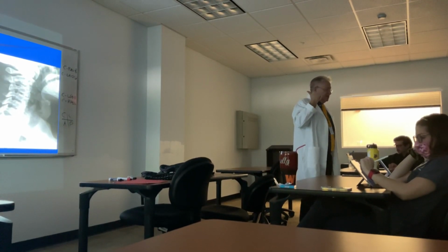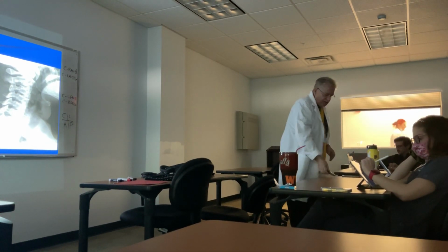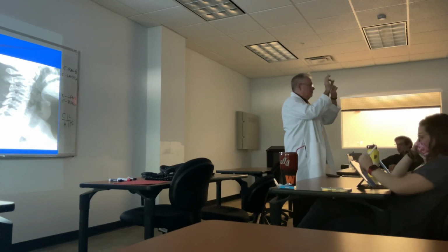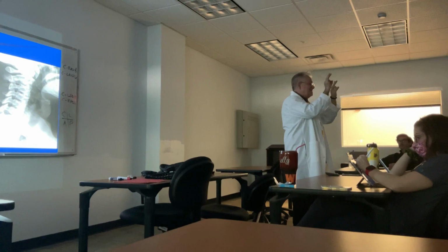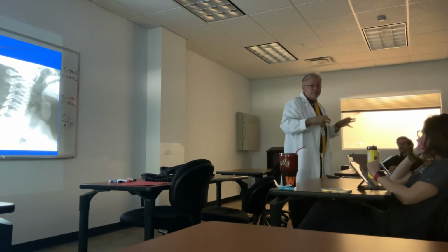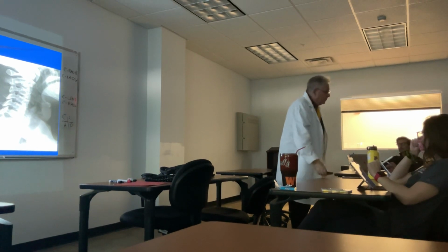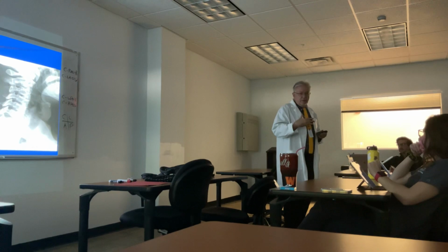A lot of chiropractic physicians don't tilt their tube. Well, if the IVF is this small, when you don't tilt the tube, it gets this small. We want to see things more clearly, not be encumbered by issues. So there's a reason why we do what we do and why we do it.